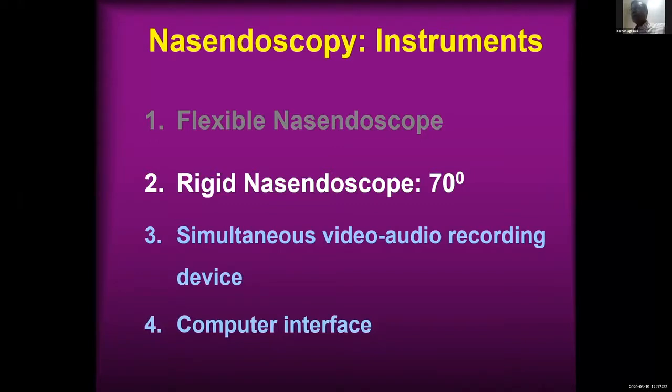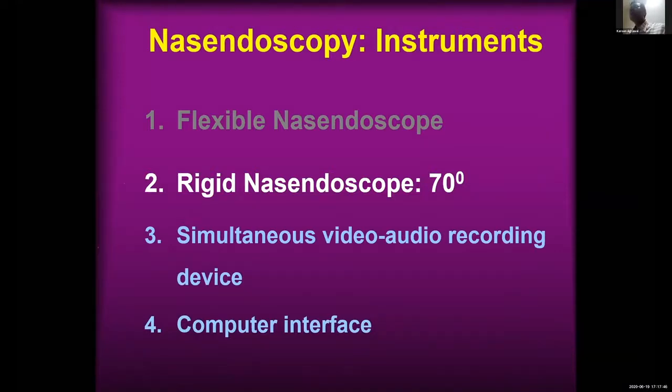And along with nasendoscope, while doing the nasendoscopy, I always record the video and audio together simultaneously through the computer interface. That is very important, because unless you have got the video recording, we cannot go ahead again and again and visualize it. So that is very important for us to recapitulate and reassess again and again in the post-operative period and follow-up as well.